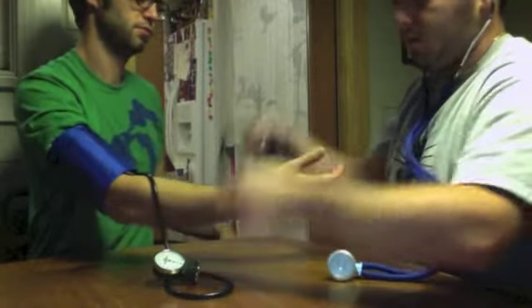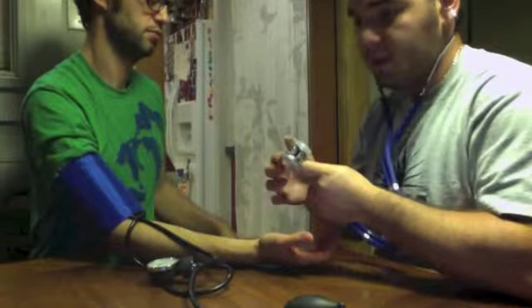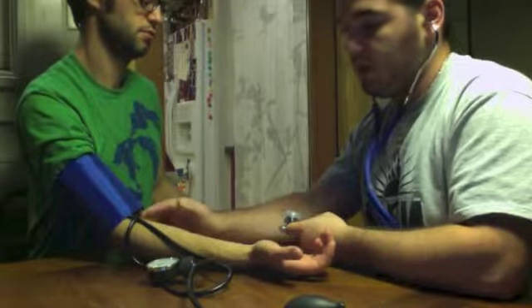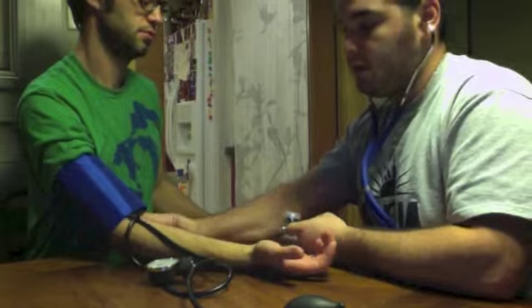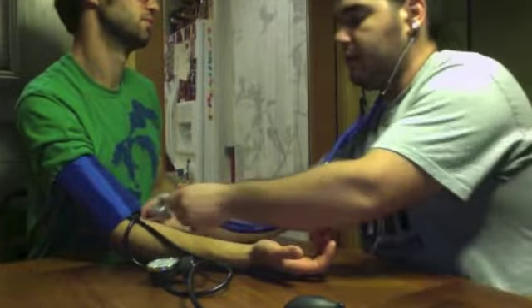I'm going to place this on the brachial artery. You can find the brachial artery about 4 centimeters above the medial epicondyle. So I can feel his brachial pulse right there.